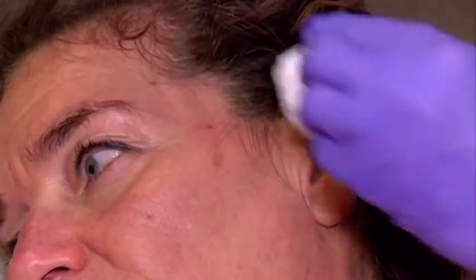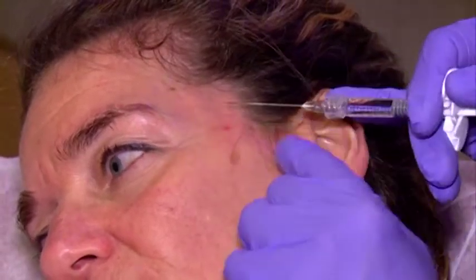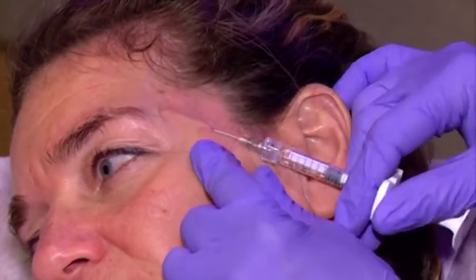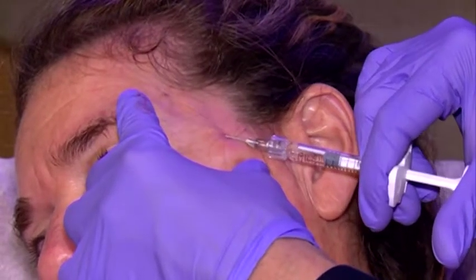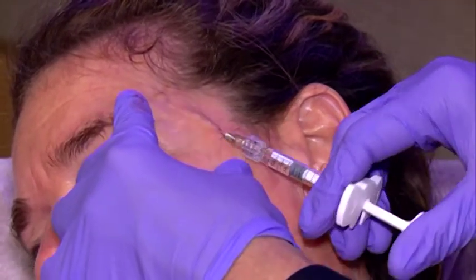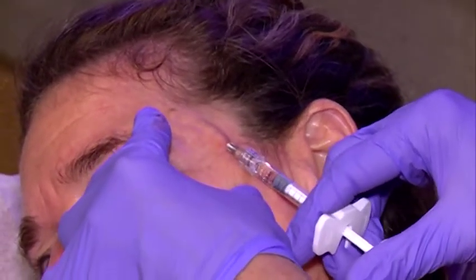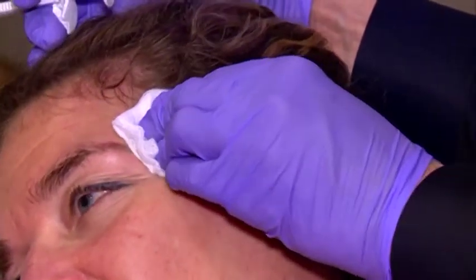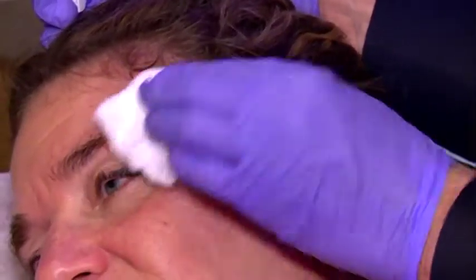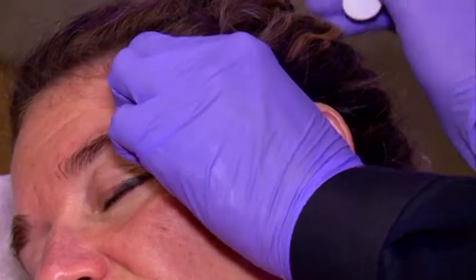Torsten, if you had a really thin-skinned patient, will that change your approach or your filler choice at all? Oh, you have to see the patient in general, but I would not think so. I would maybe be more cautious with the volume. But if the patient is really very thin, I would ask Marina and me to do a phenol peel on her. Maybe that helps a little bit anyhow. These very thin skin patients are not ideal for filling at all. But you can try, but I wouldn't change my product too much.